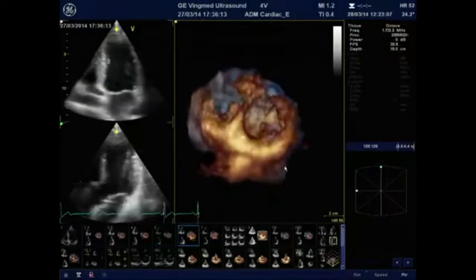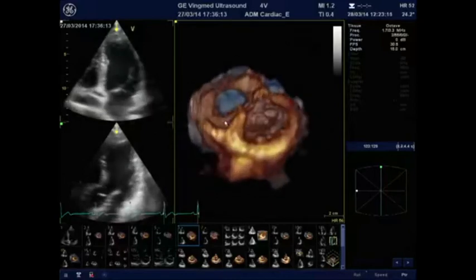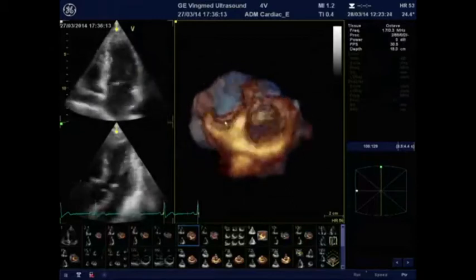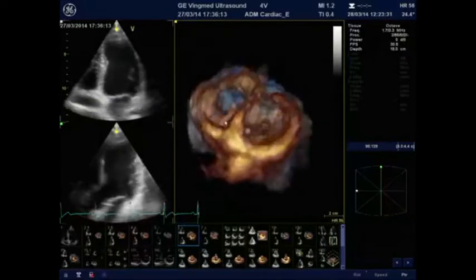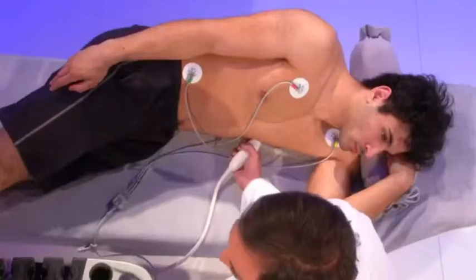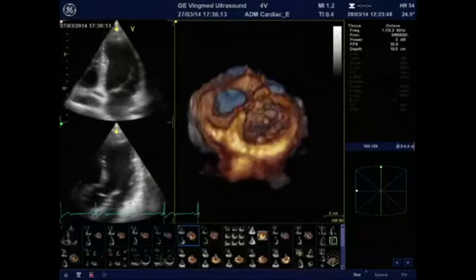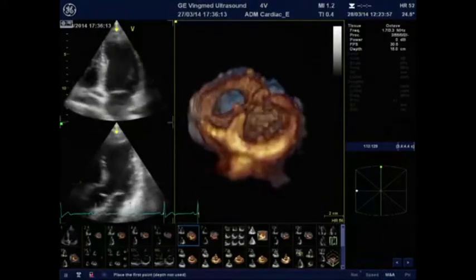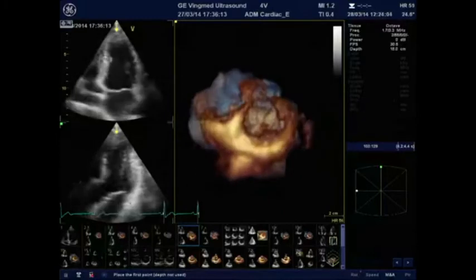Using the best compromise, we can get very nice images. Here we have a full volume acquisition, but to obtain such a high frame rate, we have to use multiple acquisitions based on triggering on the EKG. For that we also need the collaboration of the patient — they need to breath-hold during the acquisition. To have this very good image, we have to acquire four different volumes during four different cardiac cycles. The patient should not move; it's really tough if the patient has some arrhythmia, which is not the case here.